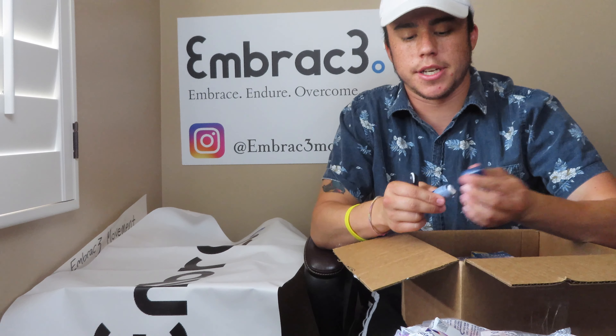We also have one, two, three, four boxes of lancets. I need to get these out because not enough of you switch your lancets as often as you're supposed to. You have to change your lancets — it avoids infection, the needle gets dull so you need a cleaner spike and more accurate blood sugar reading. Please change your lancets. I'll throw one of these in whenever I send out insulin or other supplies.